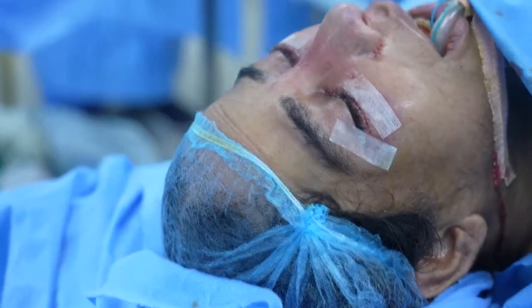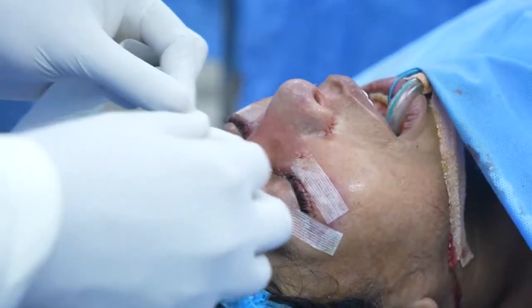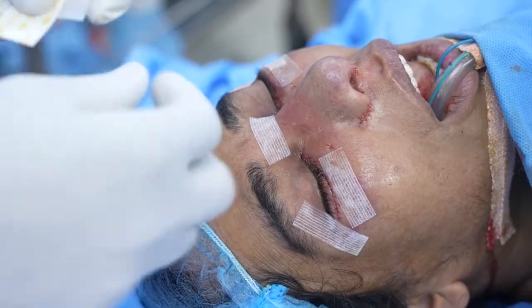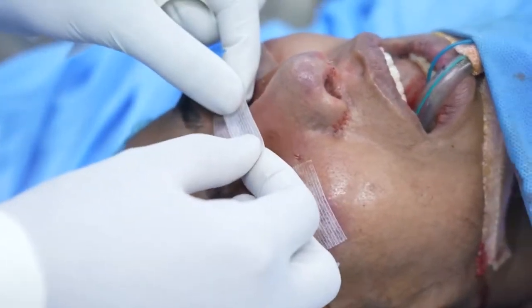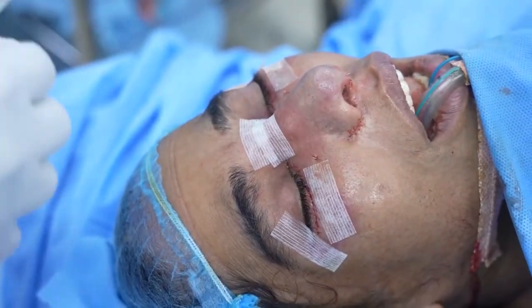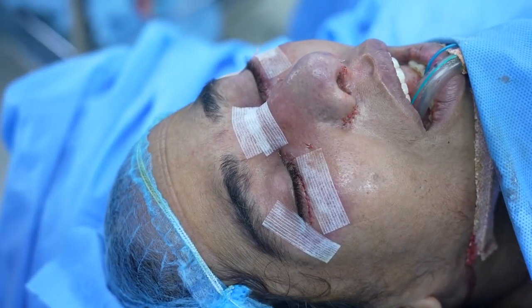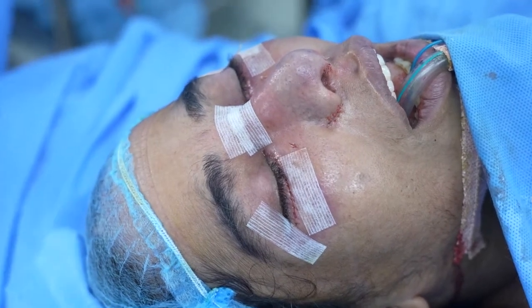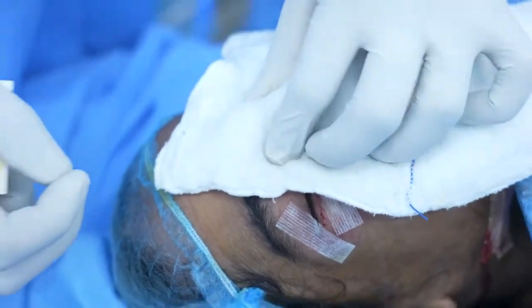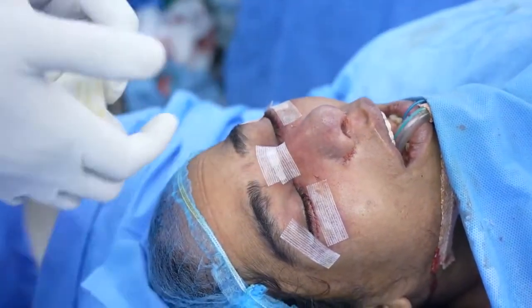So I'm going to be applying some steri strips now for this patient. And what you see is a revision rhinoplasty. The revision rhinoplasty is always challenging because not only do you have to look at what the surgeon has not done precisely, sometimes it's not the problem of the earlier surgeon at all. It's very often also the concerns the patient has. Either the patient's concerns have changed or they weren't addressed clearly to the earlier surgeon. So the results that we've got is not probably what the patient has wanted. So now in this patient we had to improve the dorsal aesthetic line. You can see I've made it a little bit more sharper.